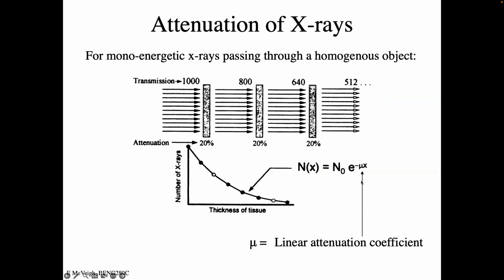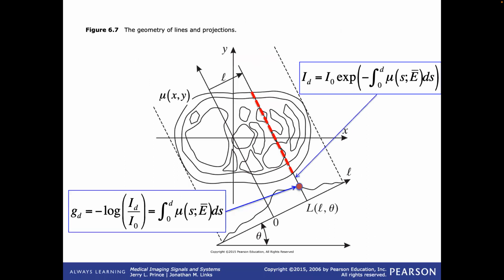This solution here. So we have I naught in this slide, and then an exponential decay that is proportional to depth, and then proportional to whatever the chemical compound is, what its linear attenuation coefficient is. So when I go through, that summation generalizes to this integral, right?